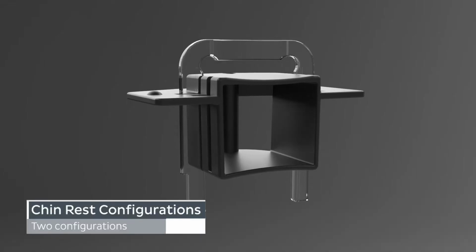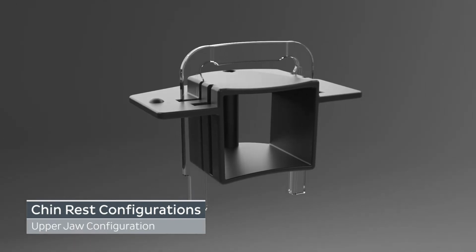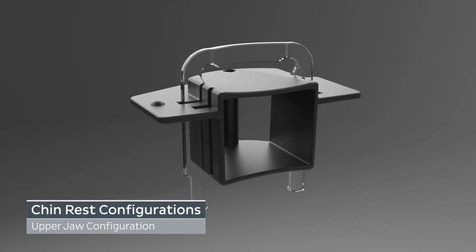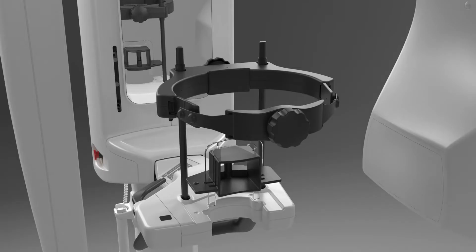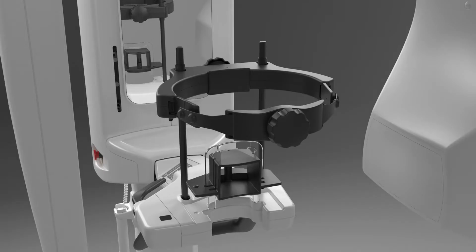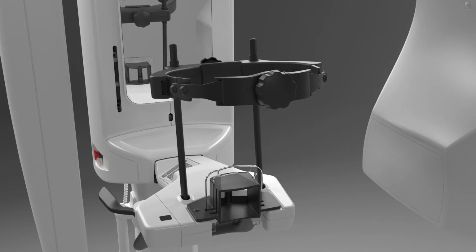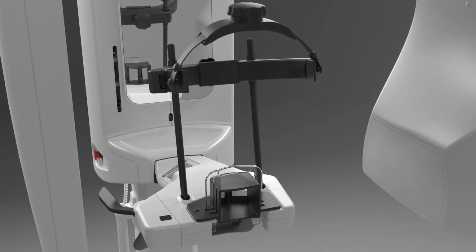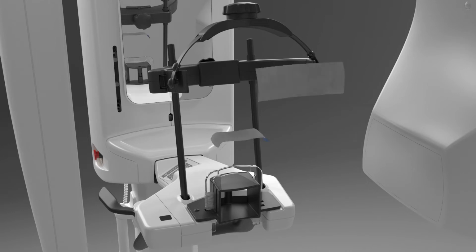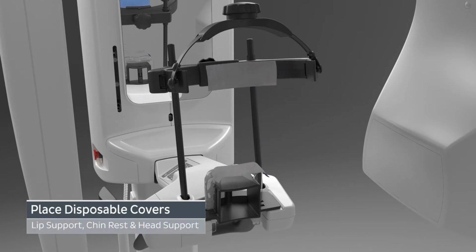There are two chin rest configurations that can be used when acquiring a 3D image, one for the upper jaw and one for lower or both jaws. With the chin rest pre-configured, place it onto the lower shelf of the device. Release the head support locking lever and move it towards the patient mirror. Pivot the back portion of the head support into its upright position. Place disposable covers on the lip support, patient chin rest, and head support.